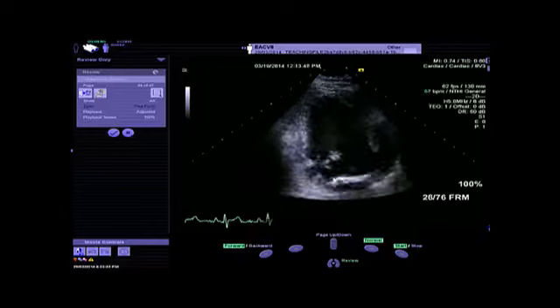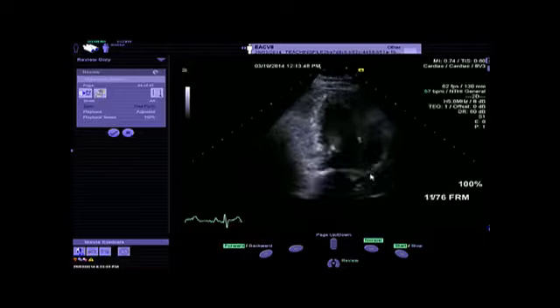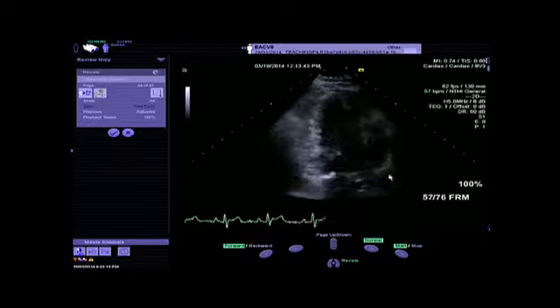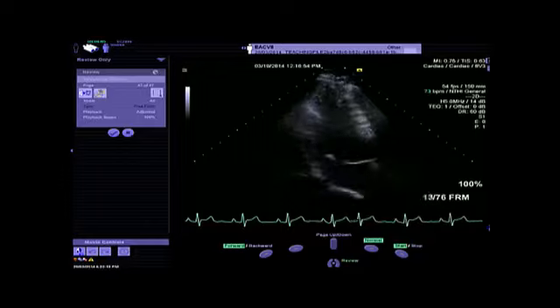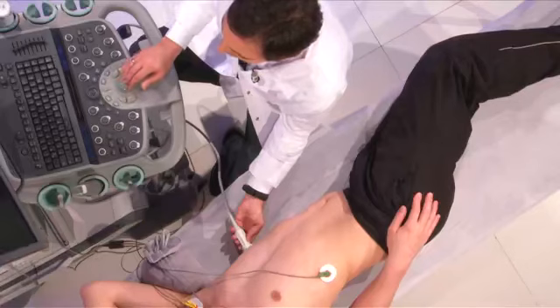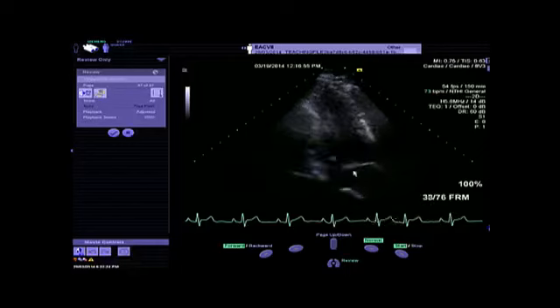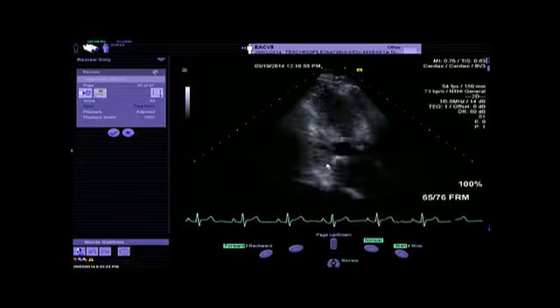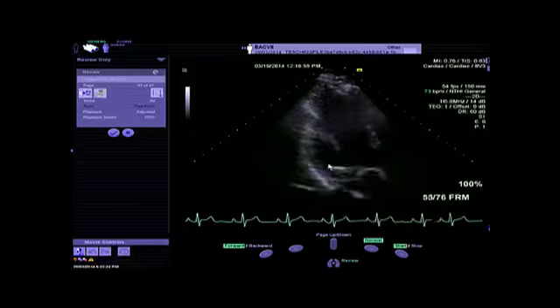And in this situation, we have a prolapse that is clearly touching both leaflets. And finally, we will tilt the probe a bit again toward the internal commissure, and here you can see A2, P2, and again this calcification of the posterior annulus, but also extending onto the left ventricular wall.